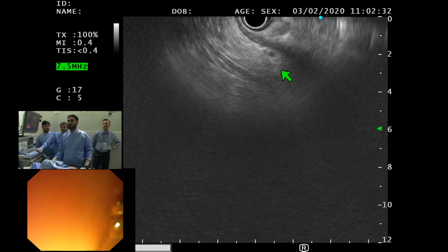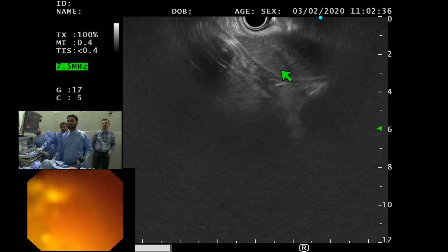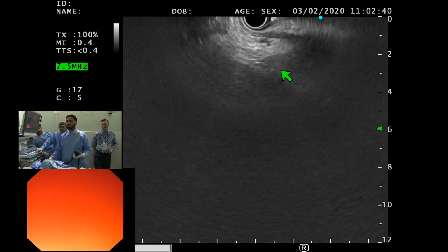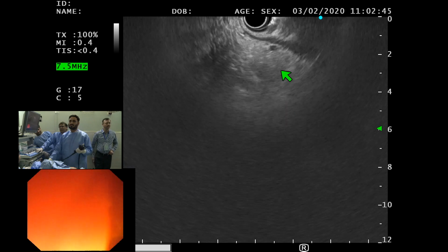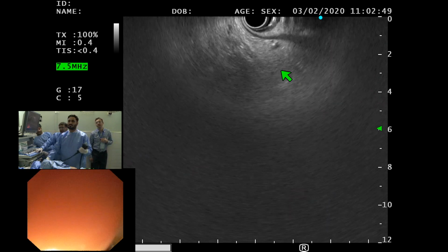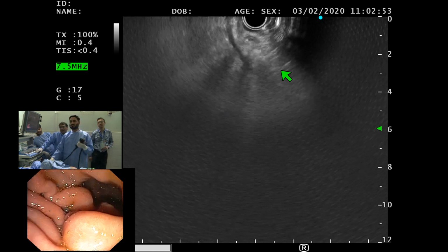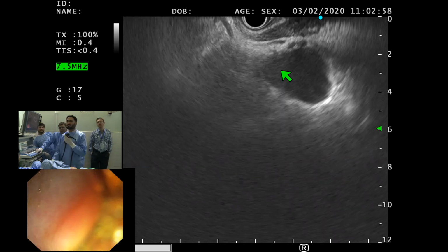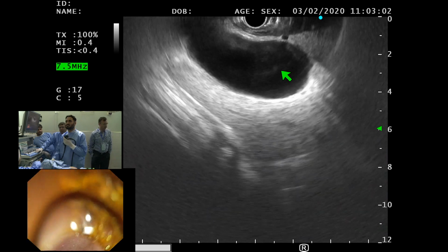Khalid bhai, would you say this is walled off necrosis or not walled off necrosis? Oh, I don't see any wall around that from any angle. But the best way to take a look for that is MRI, because sometimes the distal part you can't see, but I do not see any wall around that. It's very irregular, in different stages. There are a few anechoic areas, but the majority of it is just thick necrotic tissue without any sort of wall.